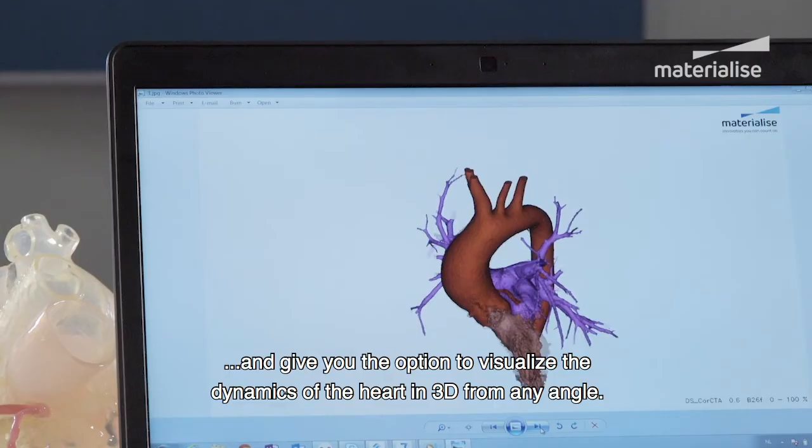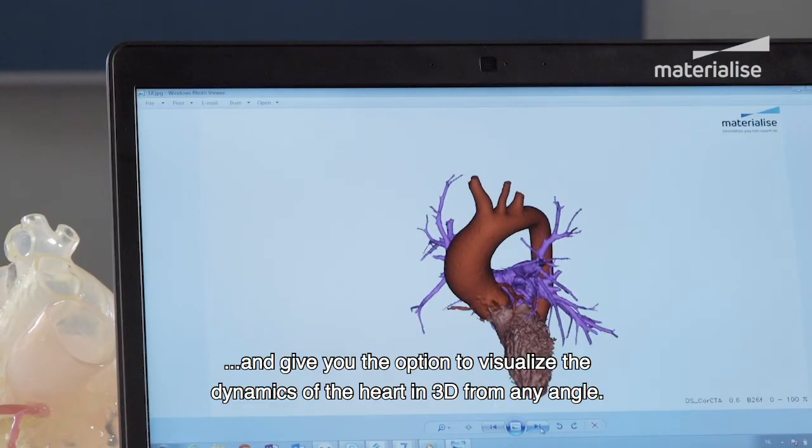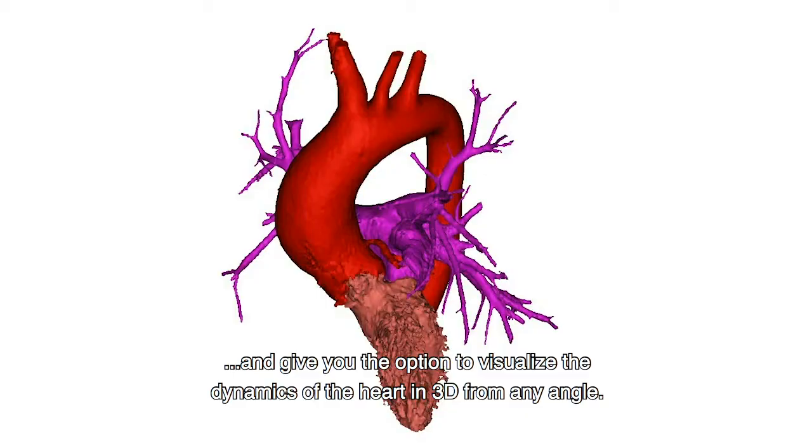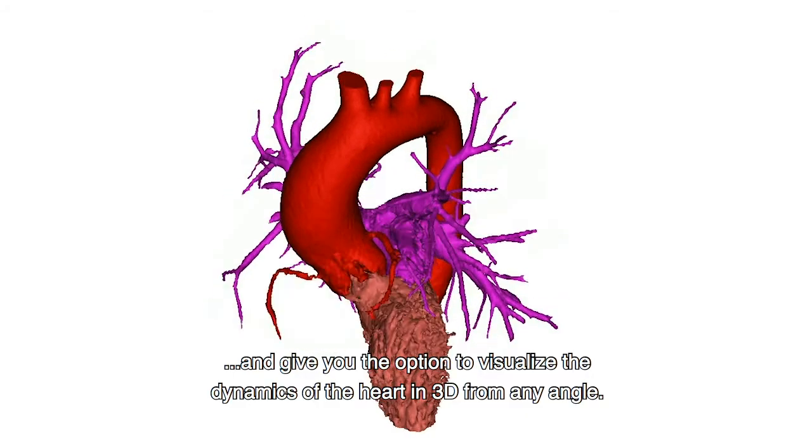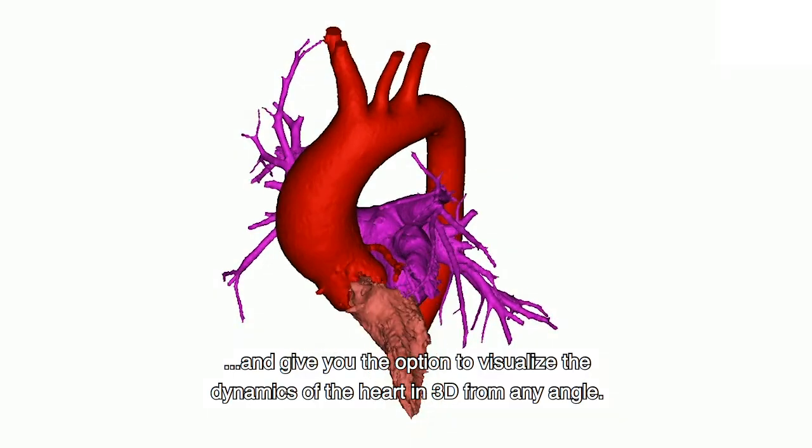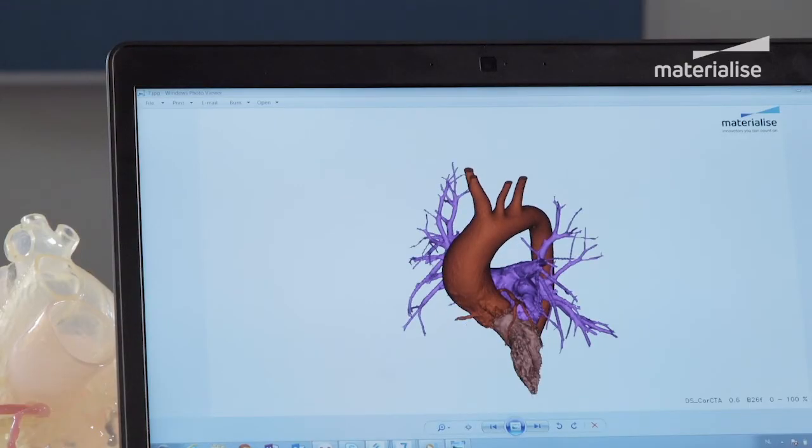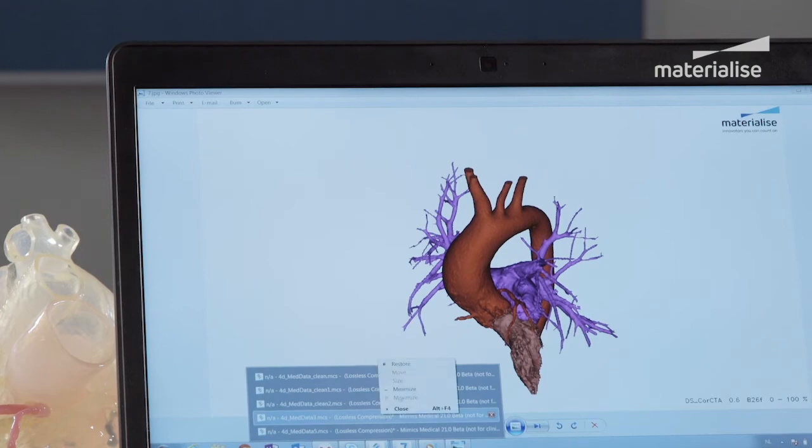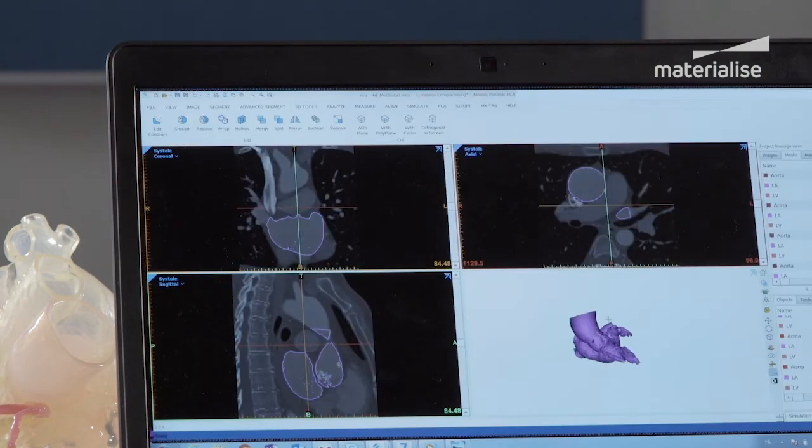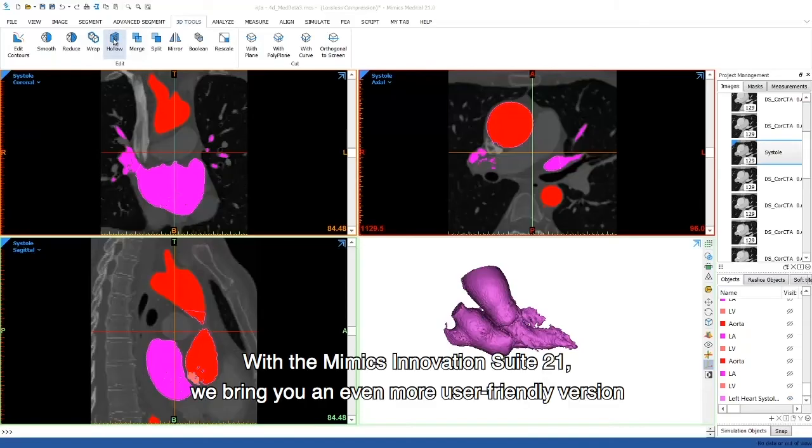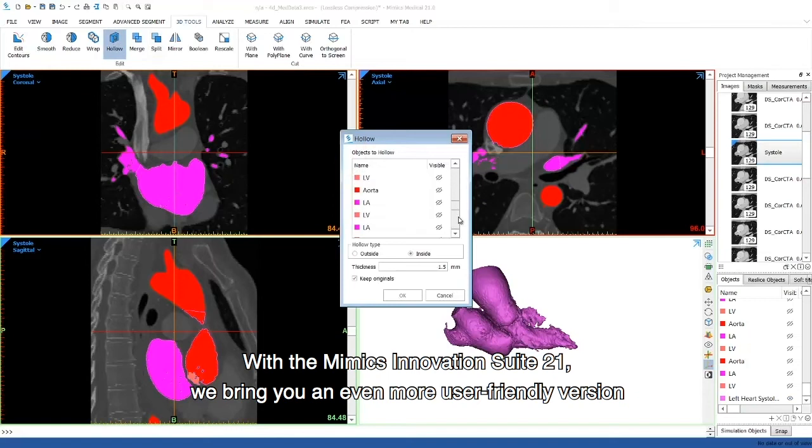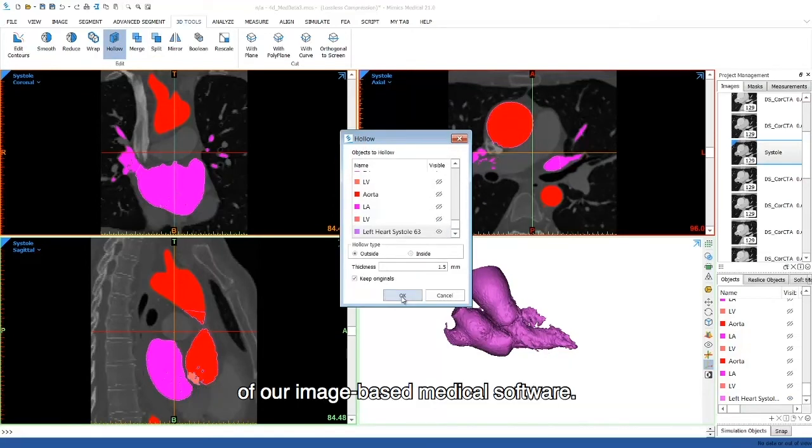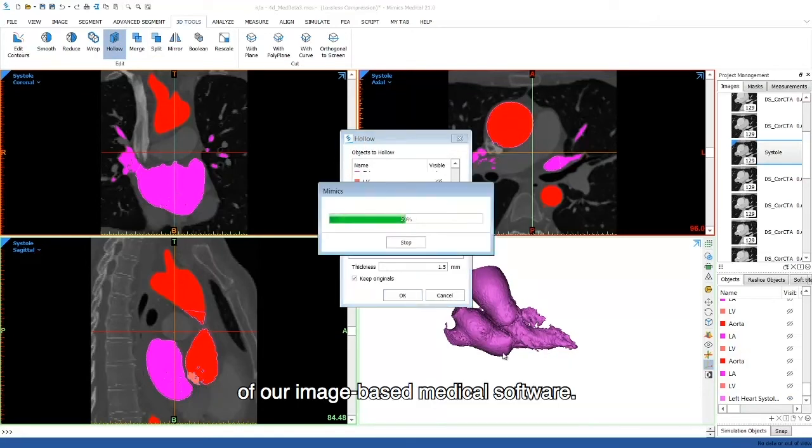And give you the option to visualize the dynamics of the heart in 3D from any angle. With the Mimics Innovation Suite 21, we bring you an even more user-friendly version of our image-based medical software.